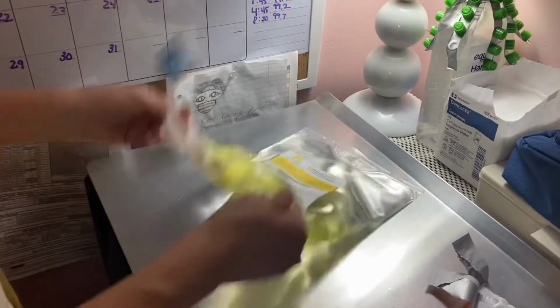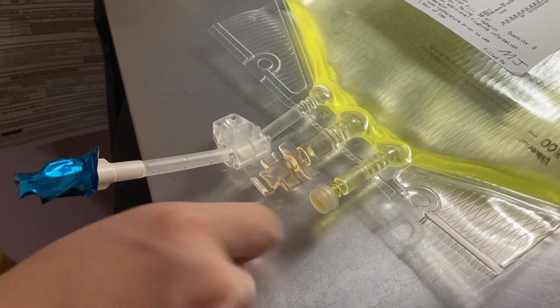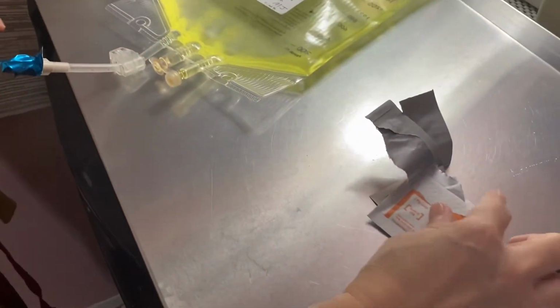Shake the bag to mix everything up. I also find it's best to hit the bag to get the air bubbles to rise to the top. We are now ready to spike this bag and prime. To do so, we'll twist off the cap from the middle port and scrub the surface for 15 seconds. You'll never do anything with that blue foil.